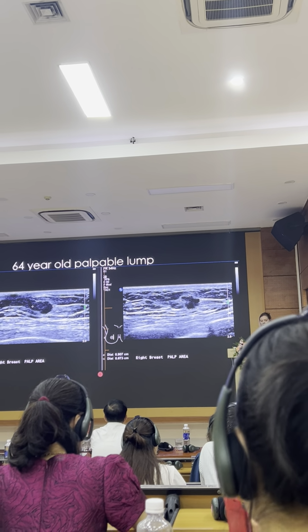Here's another case of a 64-year-old that presented with a palpable lump. You can see here this irregular mass. That was another biopsy-proven invasive ductal carcinoma.